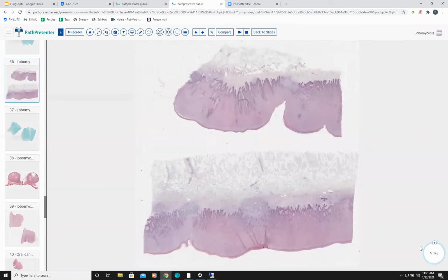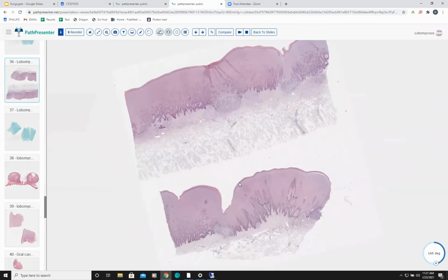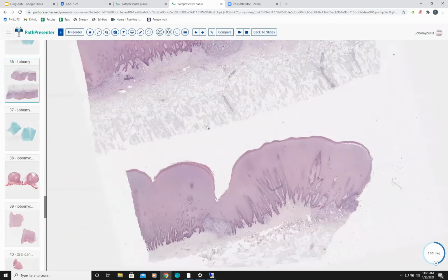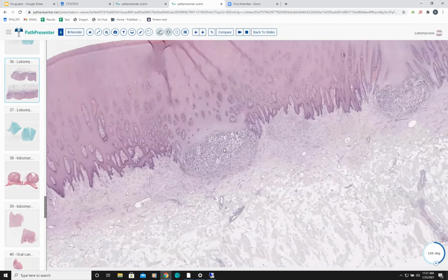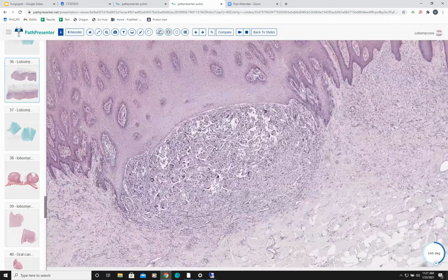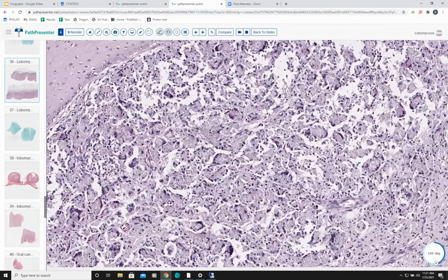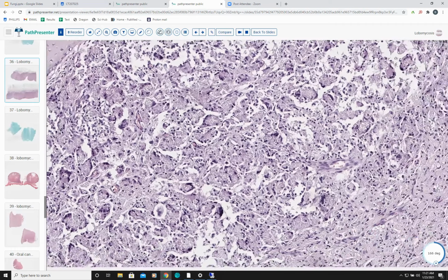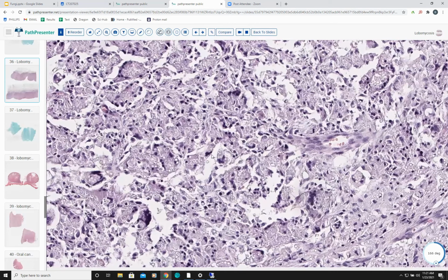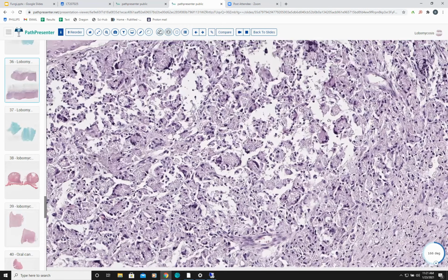Here's just another case of lobomycosis. Beautiful large biopsy, and this one had unusually pseudoepitheliomatous hyperplasia, which is rarely reported in lobomycosis. Granulomatous infiltrate. And I think here are organisms, there's one. And these are, again, just negative because they don't stain with the H&E.